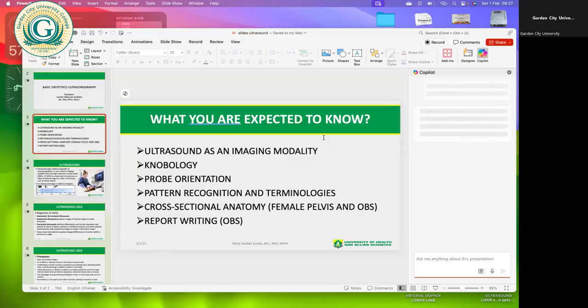And to bolster that, you should know some of the terms that are used to describe what we see, so that it could be universally accepted. So if you are seeing something that is dark, how do you describe it so that everybody who is into that practice would be able to tell?